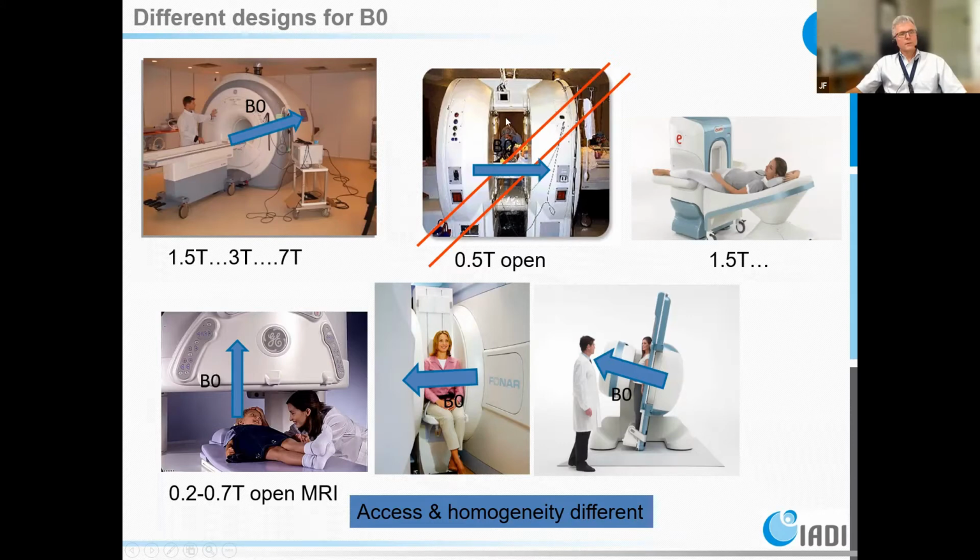And this was for surgery. And you see the surgeon in the middle here. The patient is here, and it was like in the surgery room. All the coils were just here for single use. This was very expensive, and GE stopped this system. Today, for interventional systems, you have this kind of system or this kind of system.